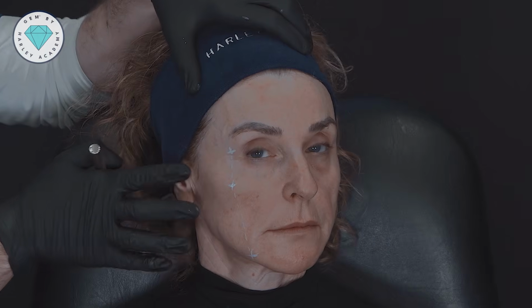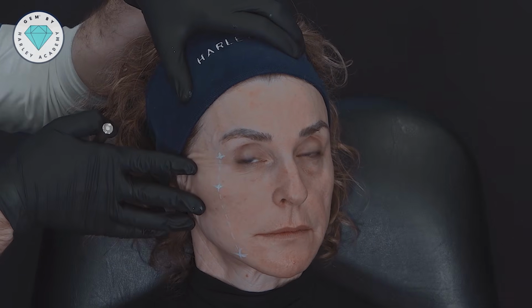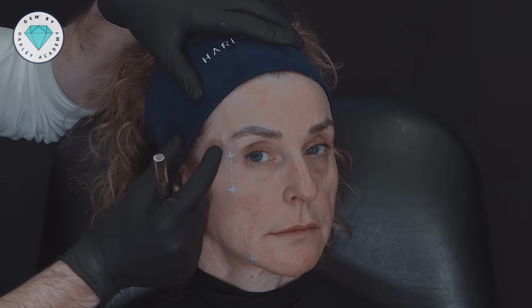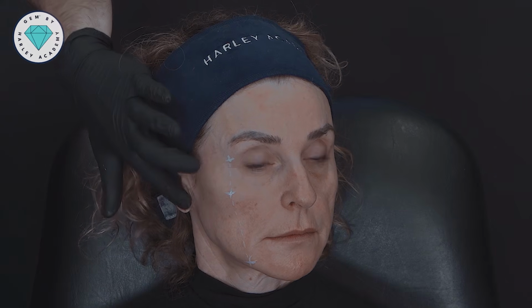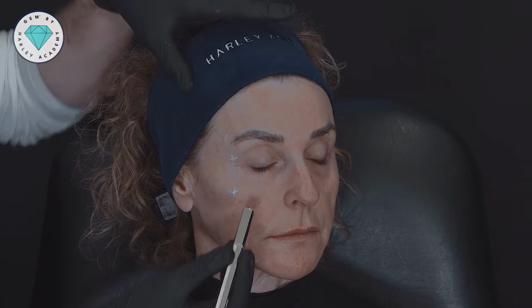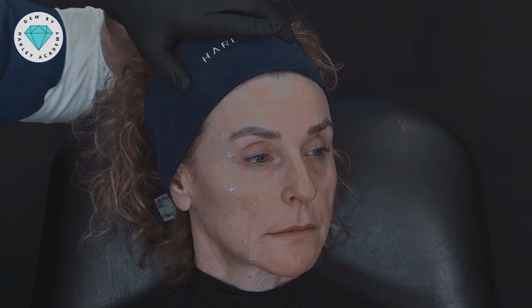The second thing is that we know that if we add volume laterally first, we need less volume medially second. And that's why it's a mistake to start to add volume here first before we've adequately volumized the lateral structures. It's been described that this part of the face is organized like layers of an onion, concentric layers where we can reposition tissues, whereas the medial cheek is more like roof tiles, where the tissues are not in a concentric layer, but on top of each other with structures transecting the layers. And so we have a lot more stability in the medial midface.